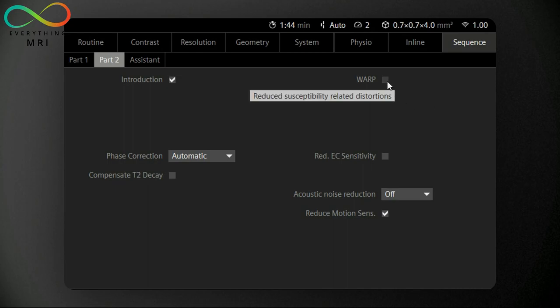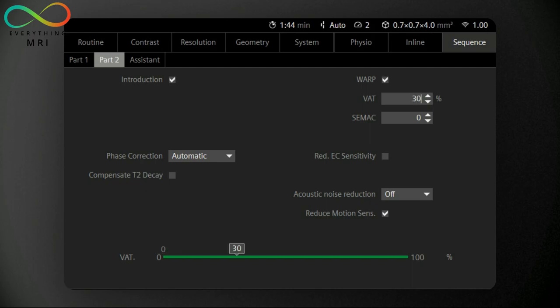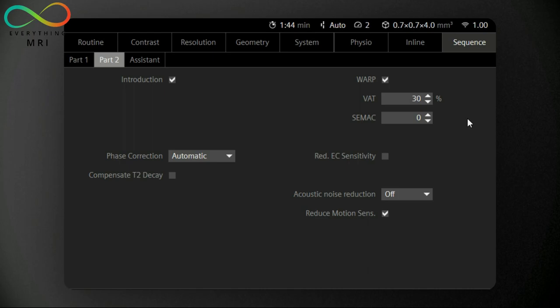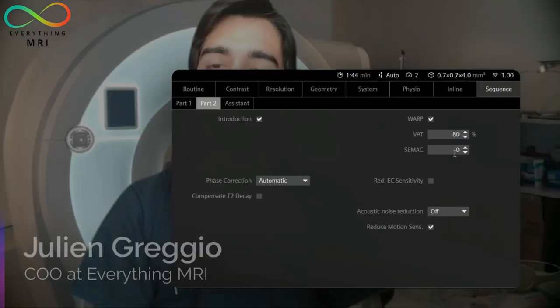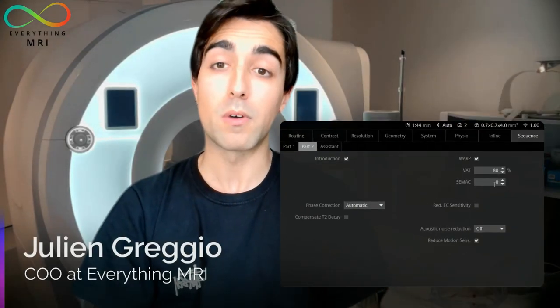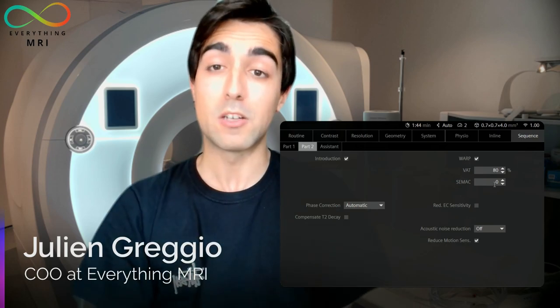VAT, also known as View Angle Tilting, is a technique that allows the user to reduce in-plane distortion by applying an additional slice selection gradient during the readout. The more we increase the percentage of VAT, the greater the degree of slice tilt and therefore its effect on our image. Generally, as we can see, this parameter does not increase the scan time, but it might cause some blurring on our images due to the fact that the slice is no longer aligned with the image object.